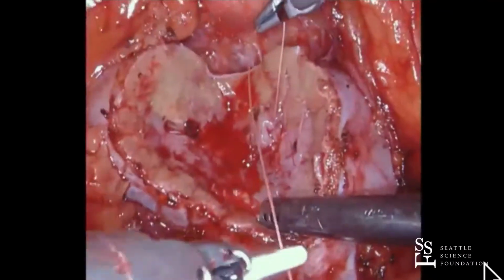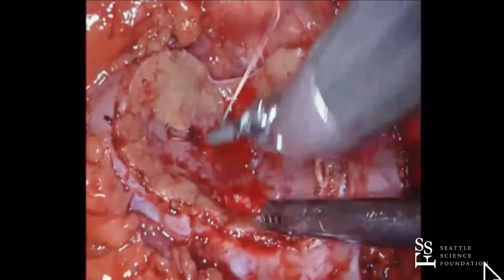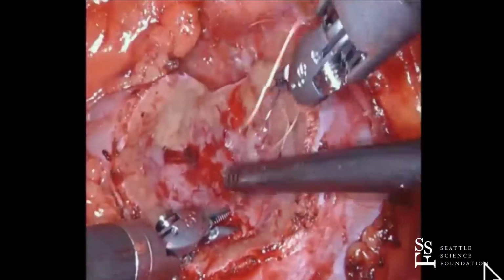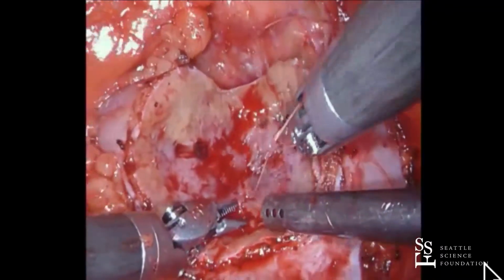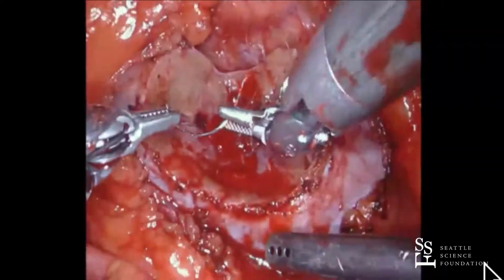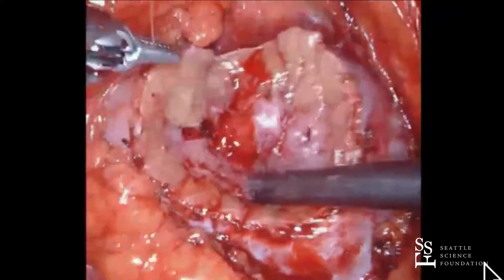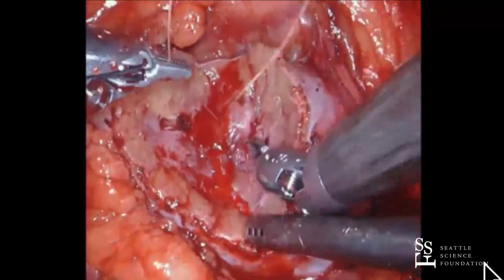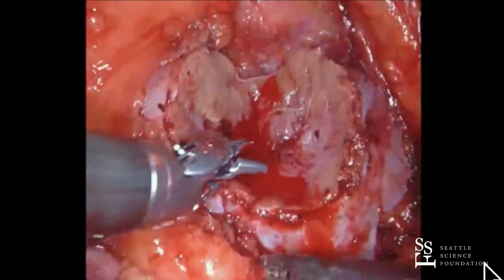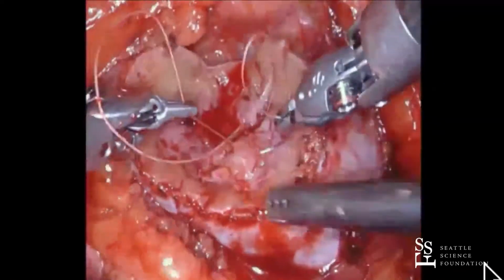So now I'm going to just do what people do with the V-Loc. I'm just going to run it across the vessel. Suck, please. And there's not a lot of big things here. It does not look like a suture cut now. But these 3-0, 2-0 micros can just break. But I don't see the cut part of this. I don't think this is suture cut.